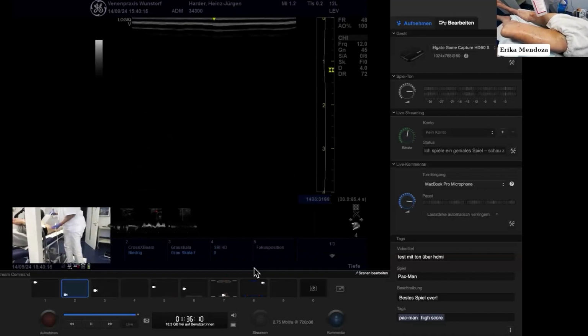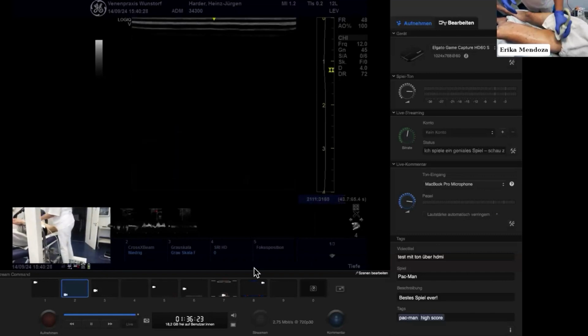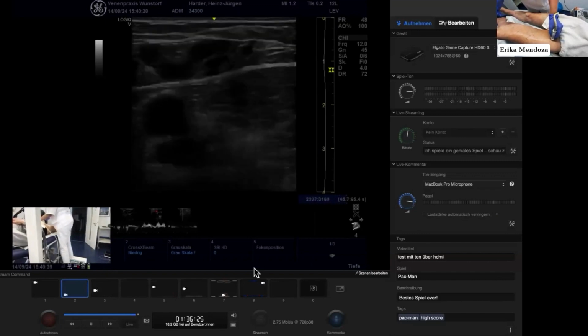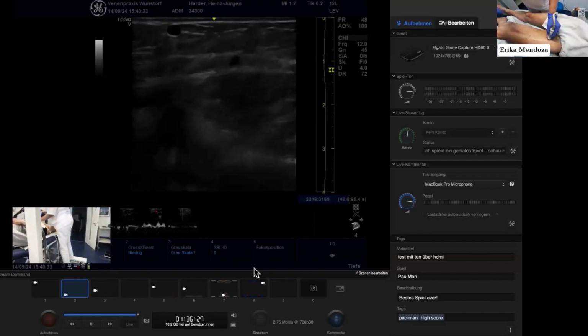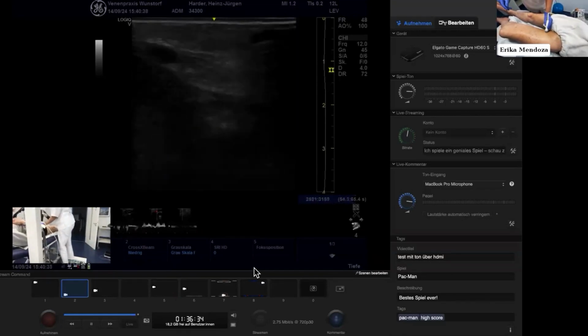This is a German producer. So chlorohexidine spray, which is a general antiseptic that we use in theater if someone is allergic to betadine. This chlorohexidine spray. We usually sterilize the probe, the duplex probe with it, the endoscopy. A lot of tool can be sterilized this way. Chlorohexidine spray. Excellent. Yeah.